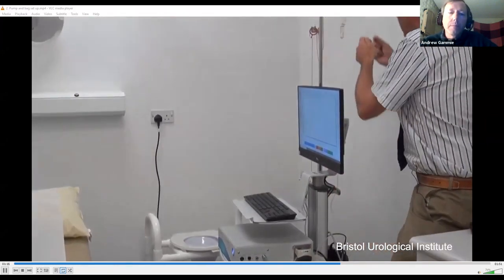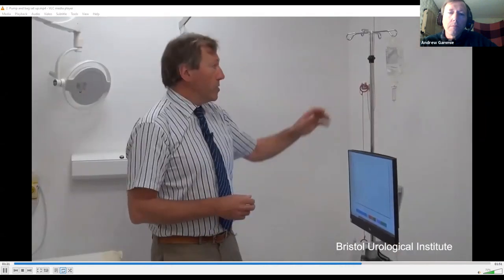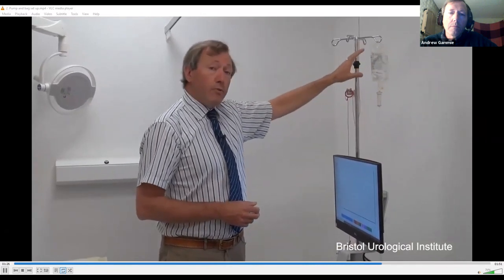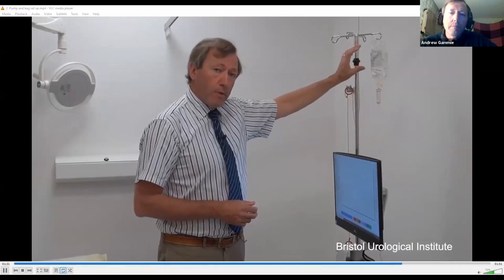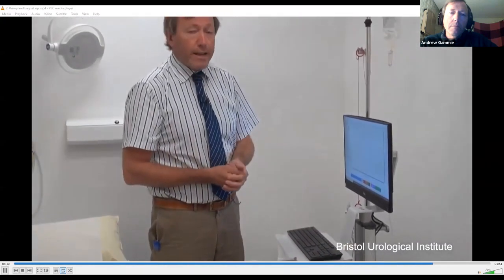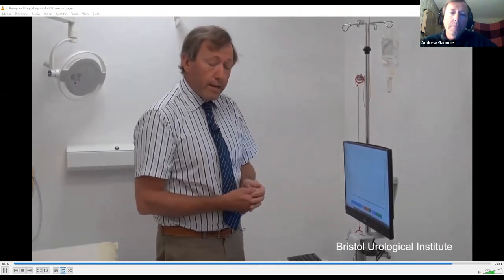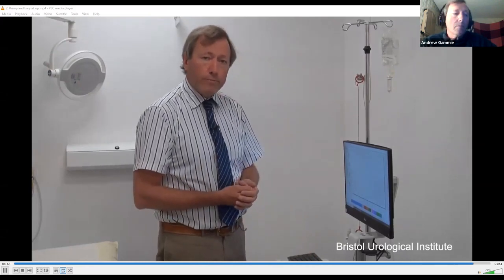Now I've got that hung up and ready for the patient when they arrive. On some machines, you'll find that the bag is suspended on a weight transducer, and that measures the amount of fluid that has been pumped in by the difference in weight that it's measuring. In this case, the volume is measured by the number of revolutions of the pump, and we normally find that's perfectly accurate enough. So there's no weight transducer required for the bag, it is simply volume computed by the pump revolutions.